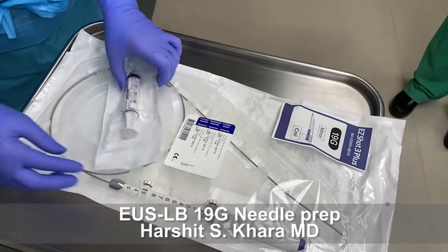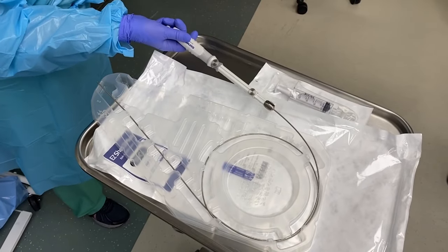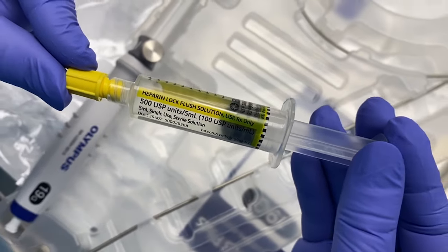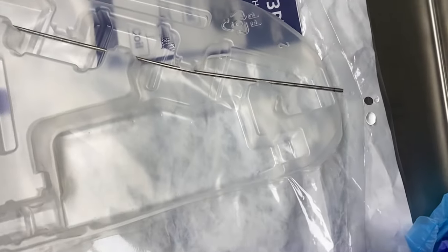The prep for the needle is performed by removing the stylet from the EUS FNB needle and flushing it with the heparin heplock solution. This solution is flushed through the channel and a few drops of heparin are expressed through the needle.